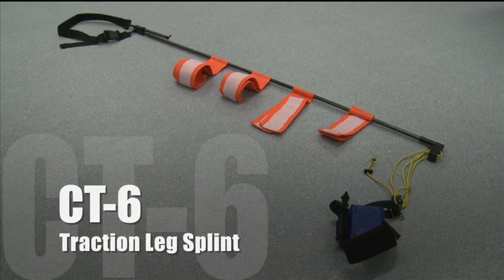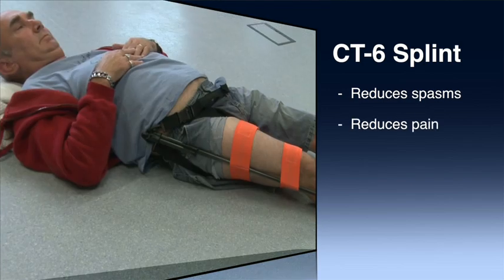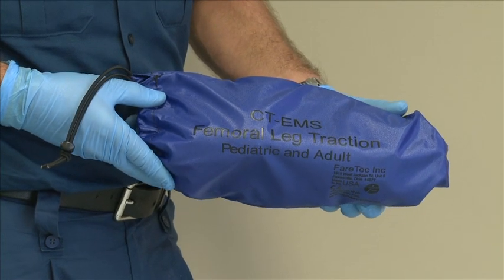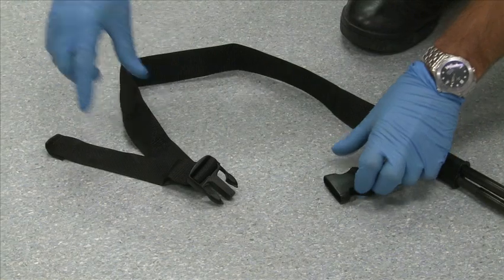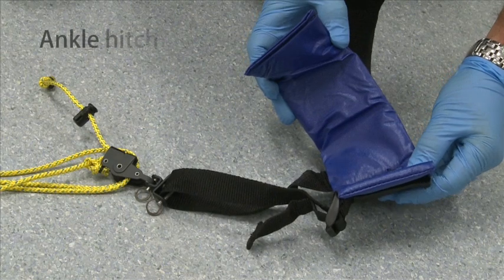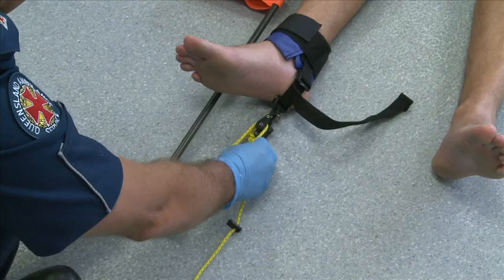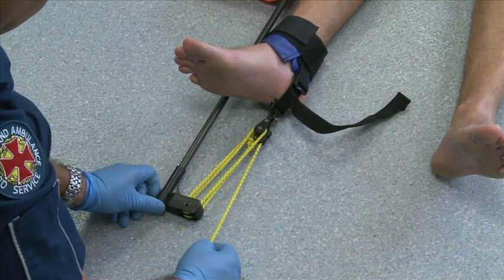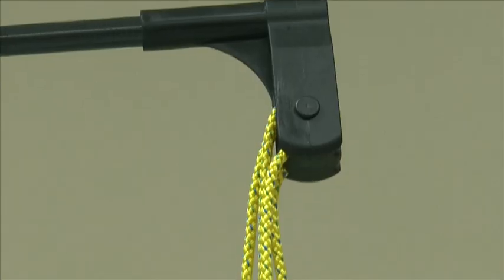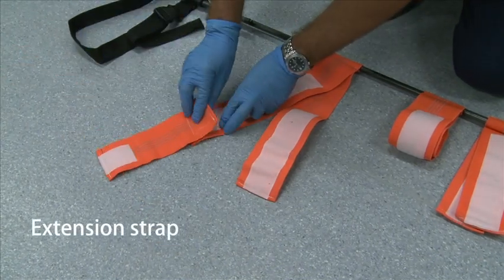The CT6 is a traction splint that aligns and immobilises femoral fractures. The splint reduces muscle spasms, pain, and helps prevent blood loss and further damage to anatomical structures. The splint comes complete in a small kit bag making it easy to store and transport. The CT6 uses an adjustable ischial strap around the upper thigh. The ankle hitch consists of the ankle strap, foot strap, and safety clip, used to hold the foot in place while traction is applied. The splint assembly comprises a multi-linked tubular frame, leg straps, and the tension adjusting block and line mechanism. The extension strap is used to lengthen the upper thigh strap for larger patients.